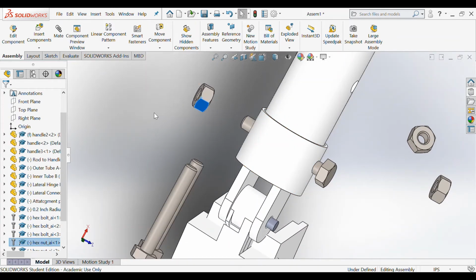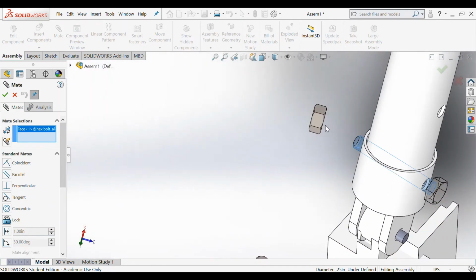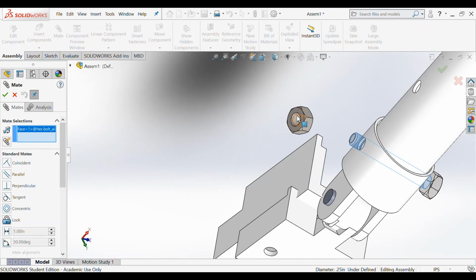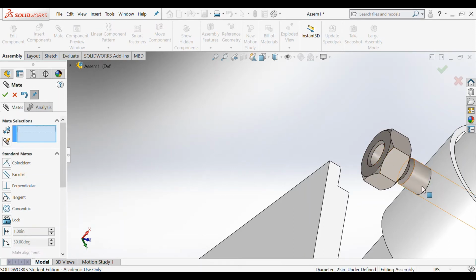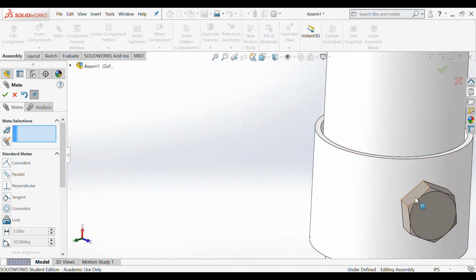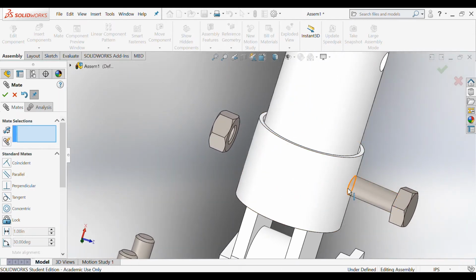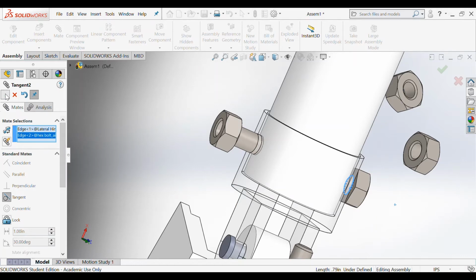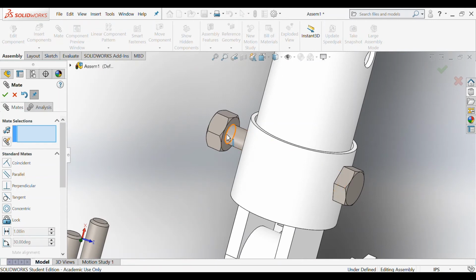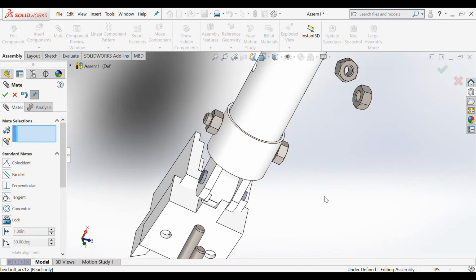And what we're going to want to do is make the outside of the long piece at the inside of the circle concentric, and then we're going to pull this guy out a little bit, and we want it to be secure on there, so we're going to select this outer circle and the outer circle right here. We're going to make those guys tangent. And then we're going to select the same outer circle over here, and on this hole we'll make them tangent as well. So this is going to keep these two pieces secure in place.